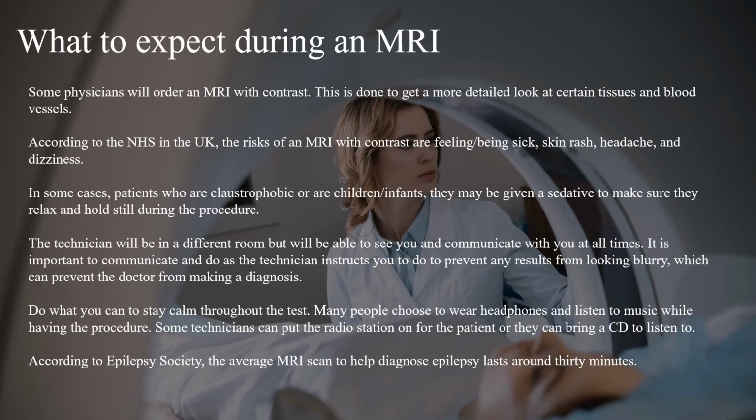Some physicians will order an MRI with contrast. This is done to get a more detailed look at certain tissues and blood vessels. According to the NHS in the UK, the risks of an MRI with contrast are feeling or being sick, skin rash, headache, and dizziness. In some cases, patients who are claustrophobic or are children or infants may be given a sedative to make sure they relax and hold still during the procedure.